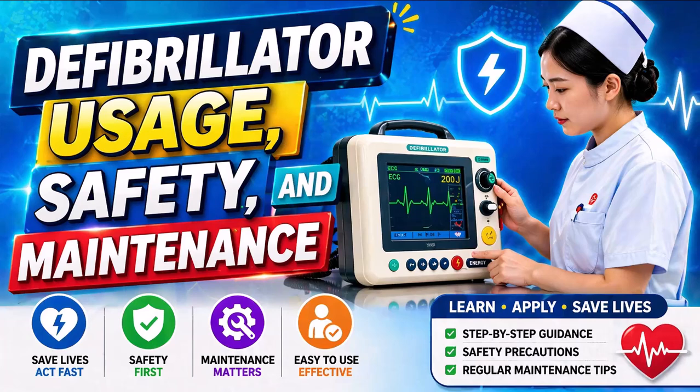Performance testing often involves using a defibrillator analyzer to measure delivered energy, charging time, and synchronization accuracy. These tests ensure that the defibrillator delivers the correct amount of energy within acceptable tolerances. Failure to meet specifications can compromise patient safety. Calibration is another important task.